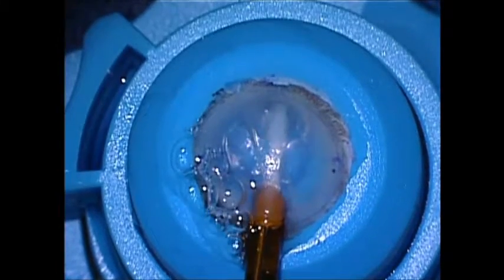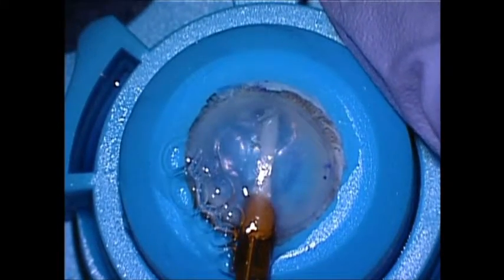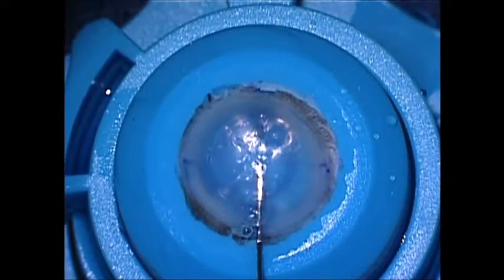Air is then withdrawn, flattening the anterior chamber, and then replaced under the center of the graft, pushing it upward against the host's stroma.